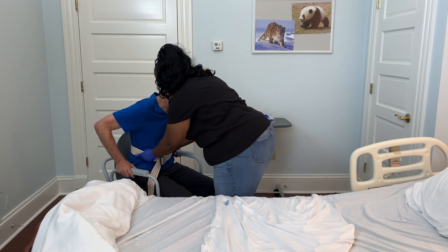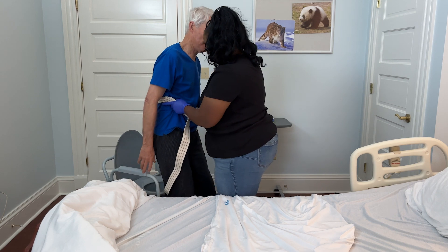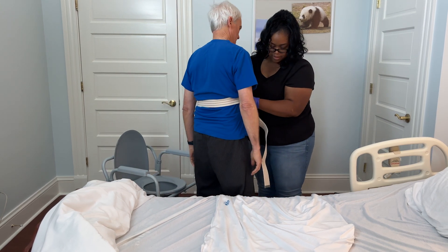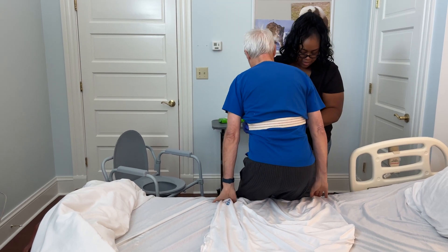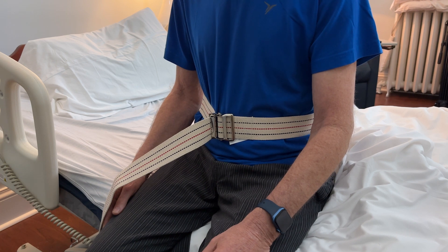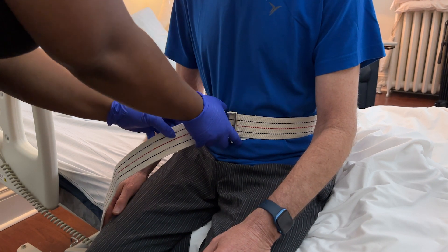Using the gait belt, pivot the patient from the bedside commode to the bed. Ensure that your loved one's legs are touching the back of the bed, then ask them to place their hands behind them and lower themselves to the bed, using their hands to assist them down gently. Remind your loved one to remain leaning forward and not to drop into the bed or lean backwards.